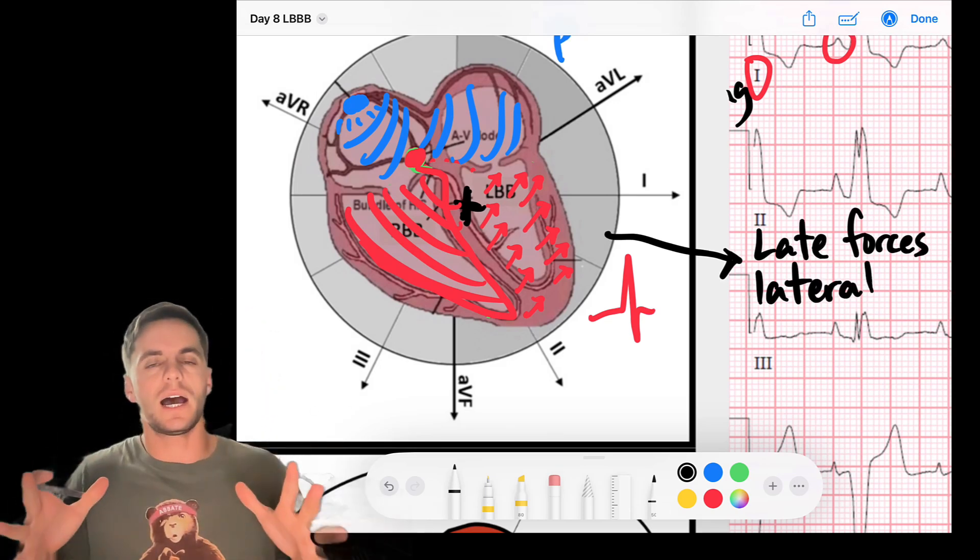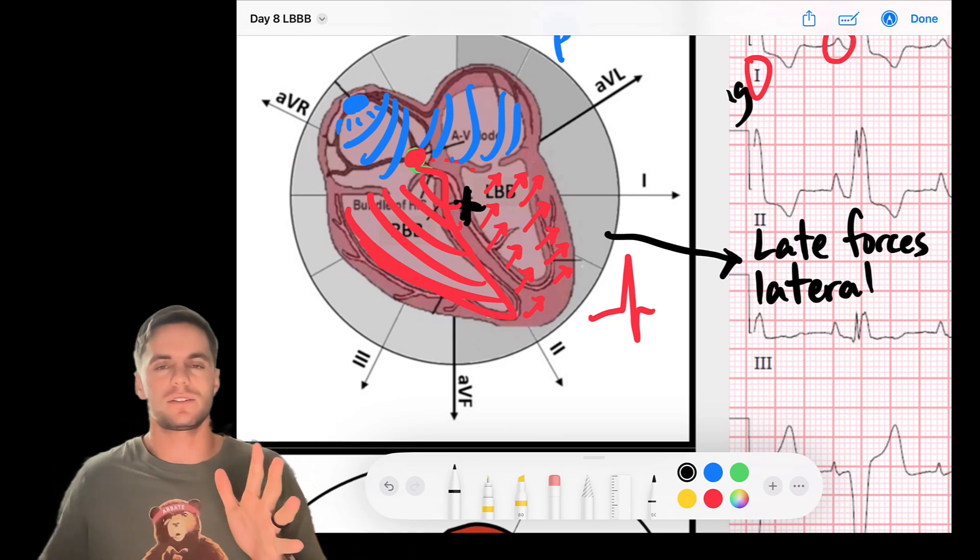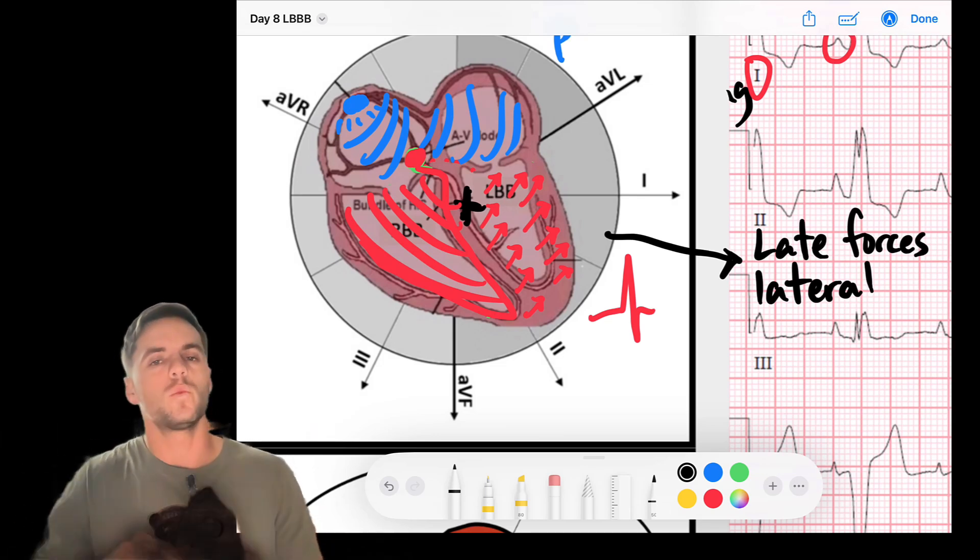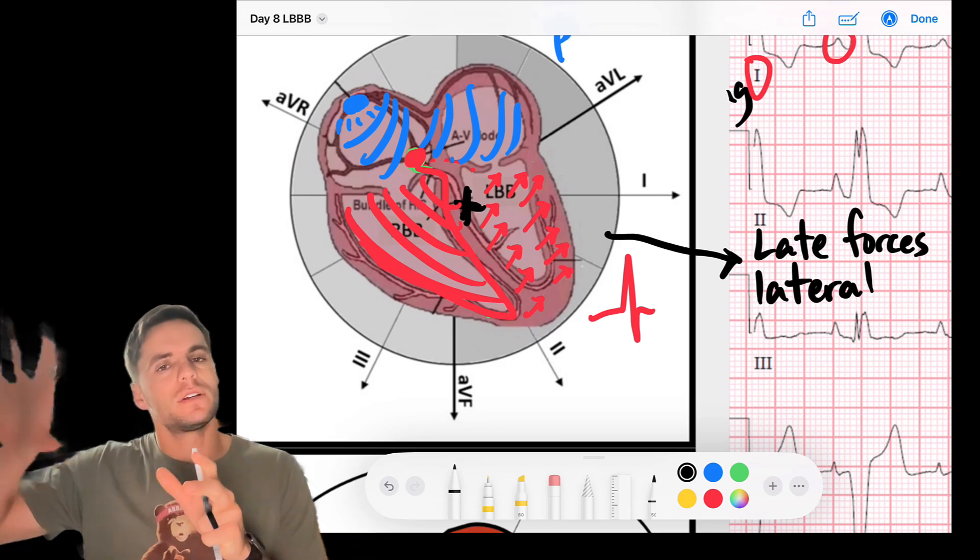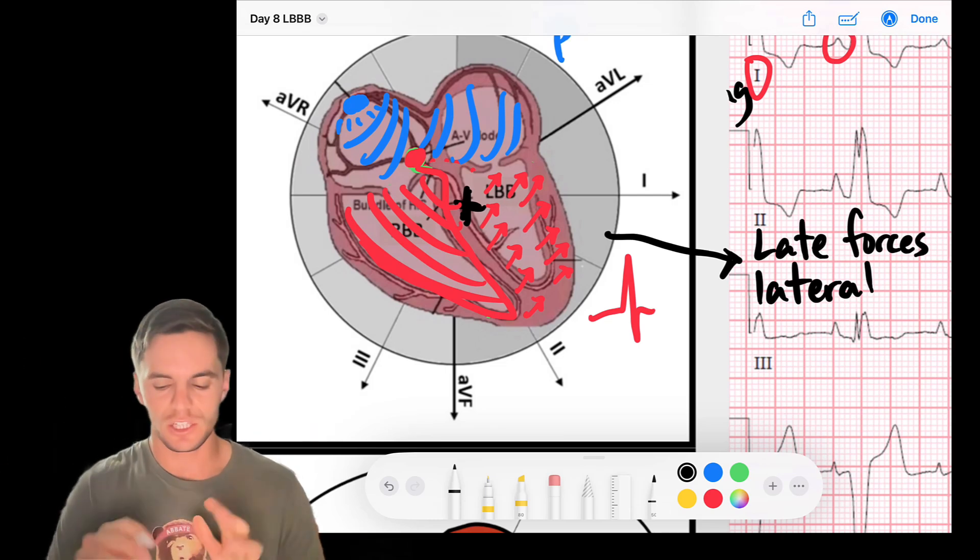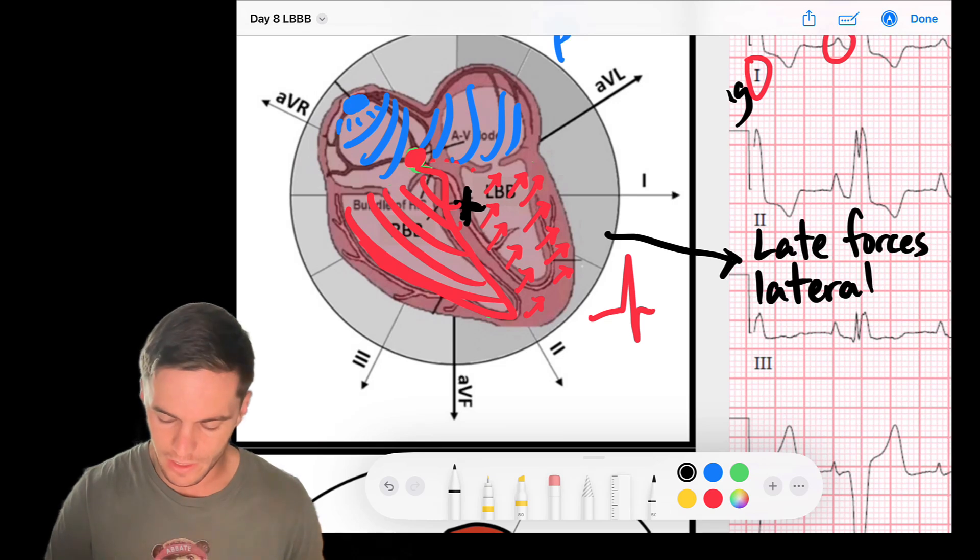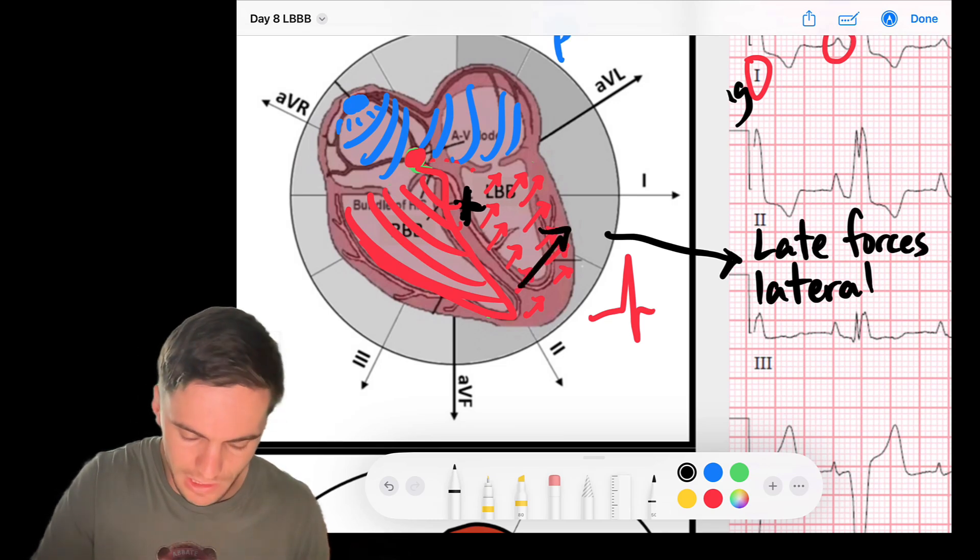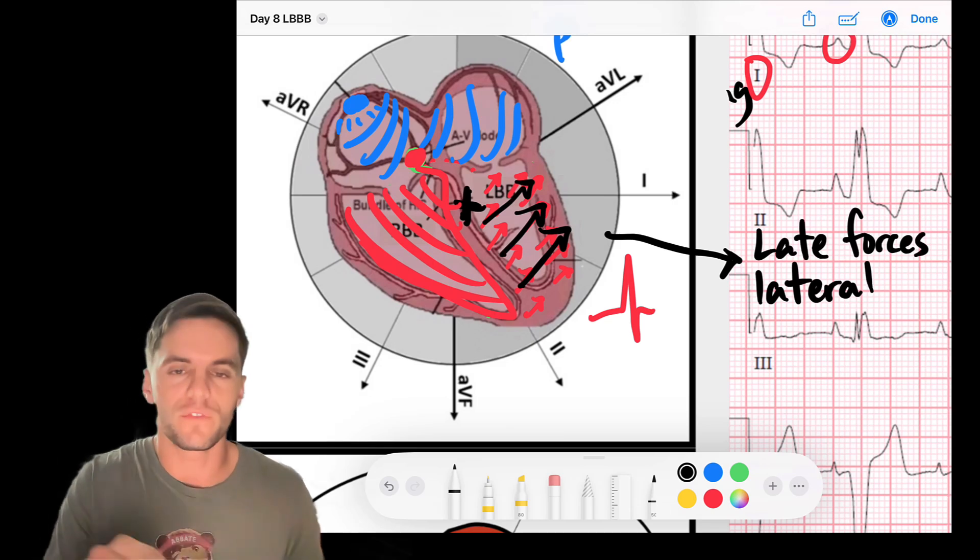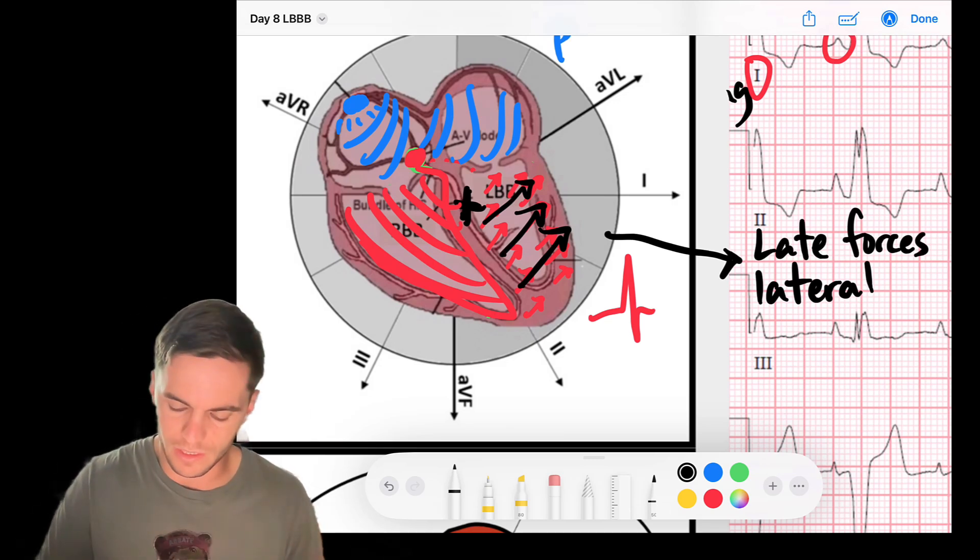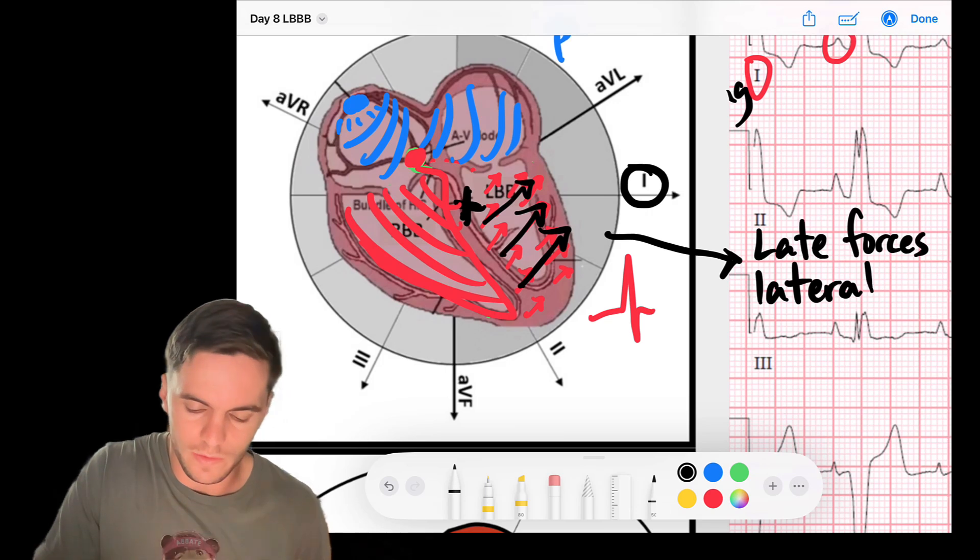So notice the direction of these forces. They're going lateral. So we're going to call this late forces heading laterally. So in the concept of time, remember time is our x-axis of our EKG. Towards the end of the QRS, we should see an extra positive deflection specifically in the leads that are lateral because we're heading in that direction. These late forces are heading to the lateral aspect.